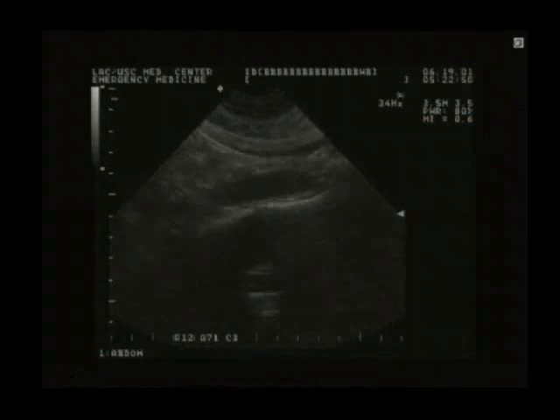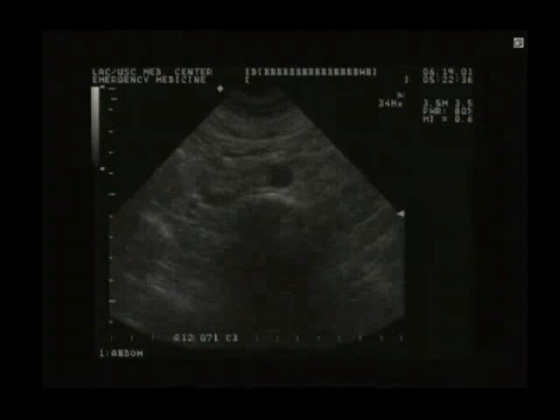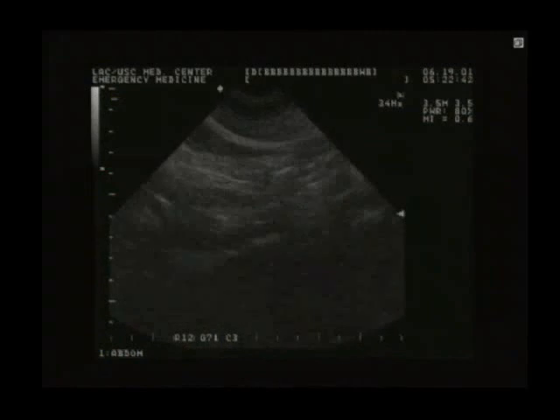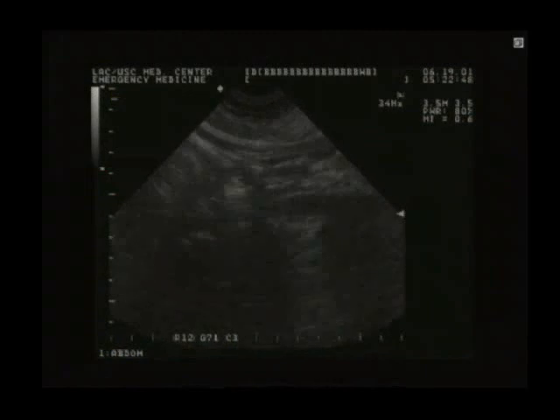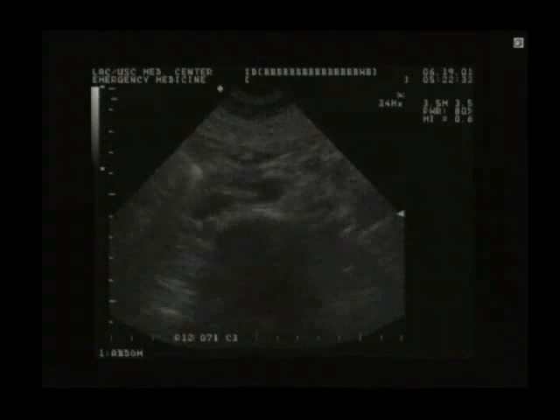Do I stop at the bifurcation or keep going? I usually stop at the bifurcation. Now, can a patient have an iliac artery aneurysm and have just groin pain? Yes. But that's beyond really the scope of what we're doing. If you really suspect something unusual like that, get a CT or a formal scan. Obviously, as you're scanning down, you could absolutely detect an iliac artery aneurysm. But we're talking really primary abdominal aortic aneurysm.